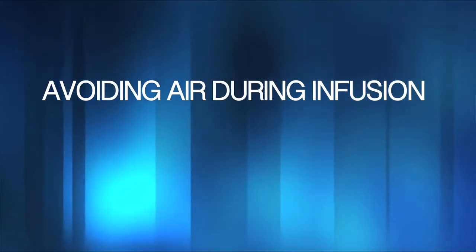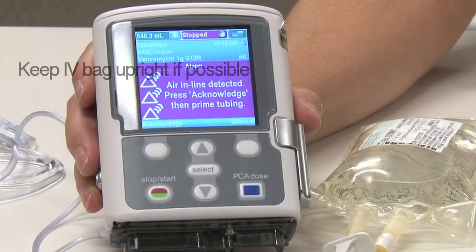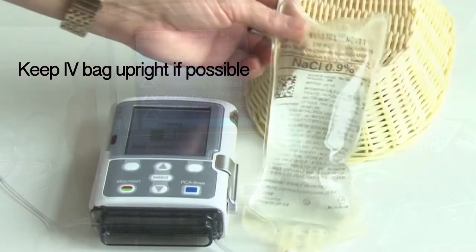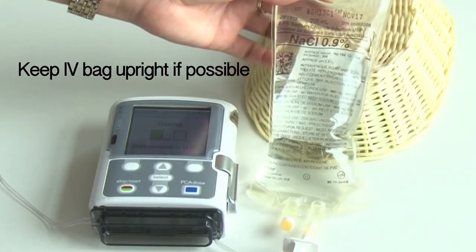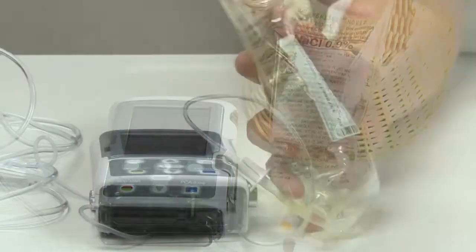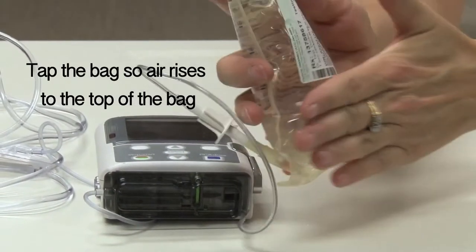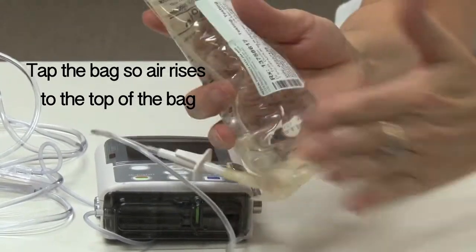Now let's look at a few tips to avoid air alarms while the pump is running. Once the pump is running, if the patient is having recurrent air alarms, you can suggest positioning the IV bag upright so any remaining air is trapped at the top of the IV bag rather than at the outlet port. You can also suggest that the patient taps the bag so any air in the reservoir remains at the top of the bag.